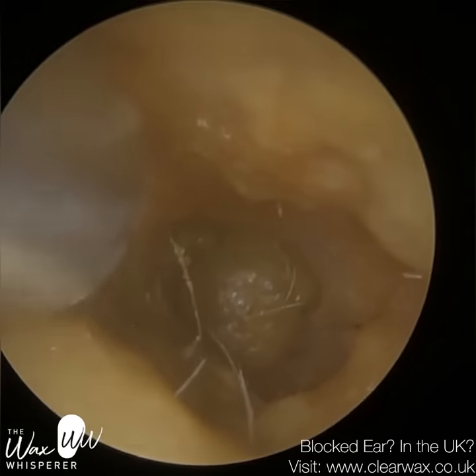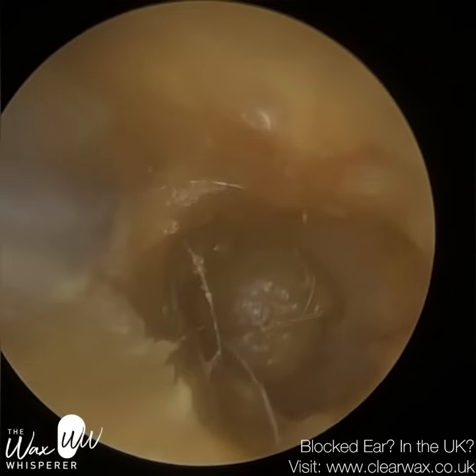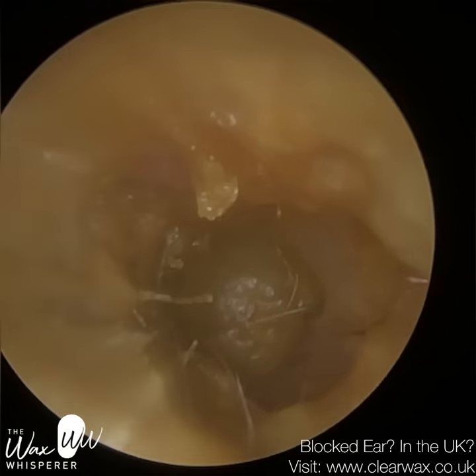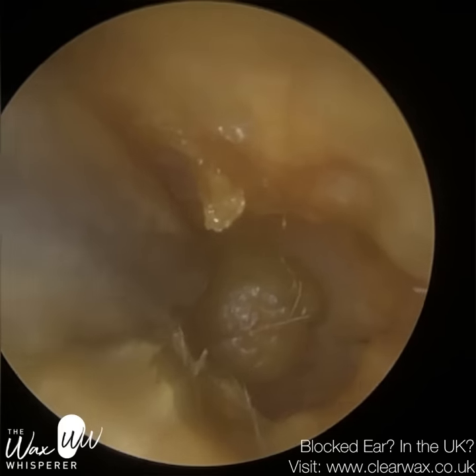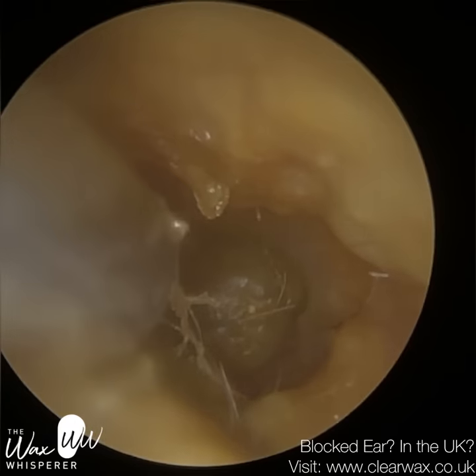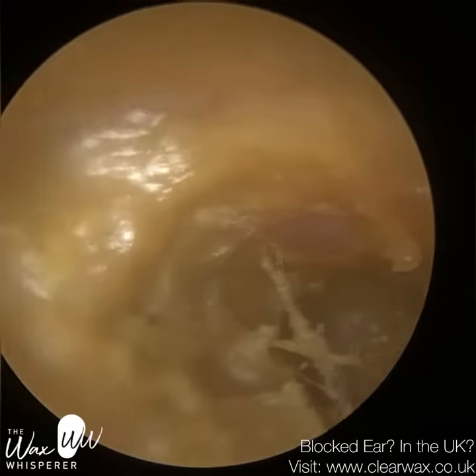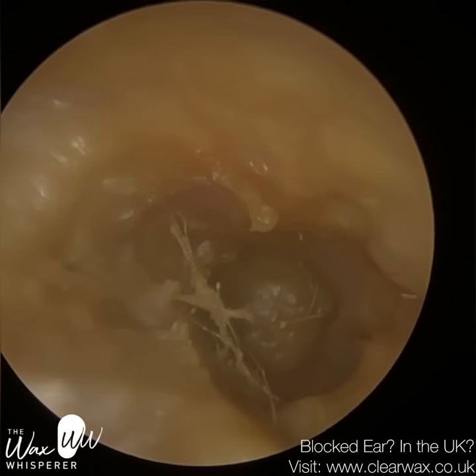The challenging bit here is to decipher how thick this layer of dead keratin and wax is on the eardrum. If I submerge and poke in too far with the suction probe thinking it's a thick layer, I can quite easily make contact with the patient's eardrum and potentially even perforate it. So I'm almost sparring with it.